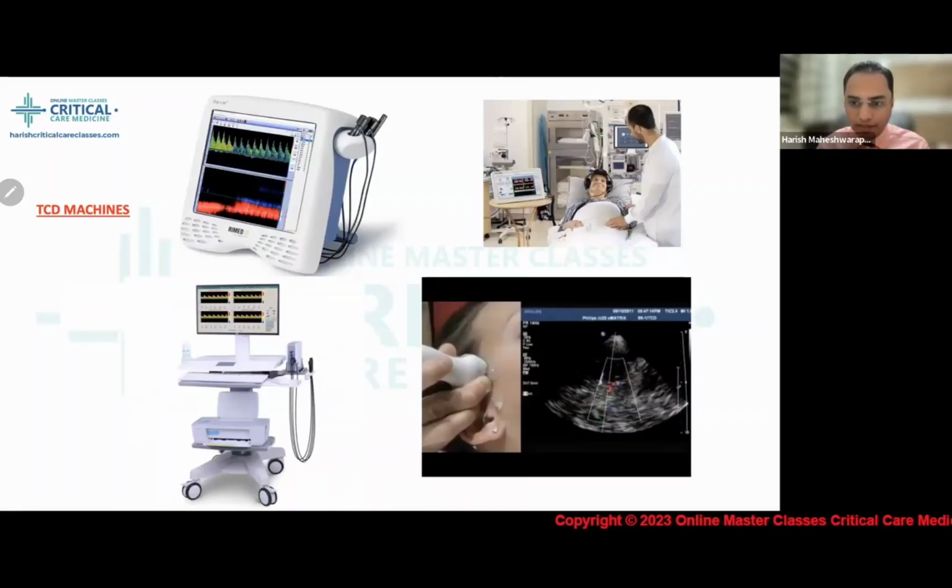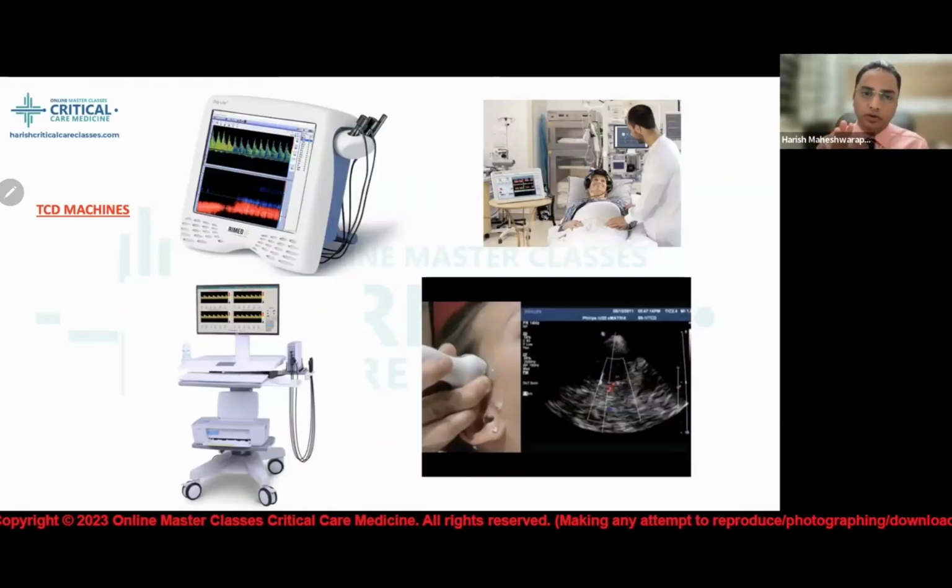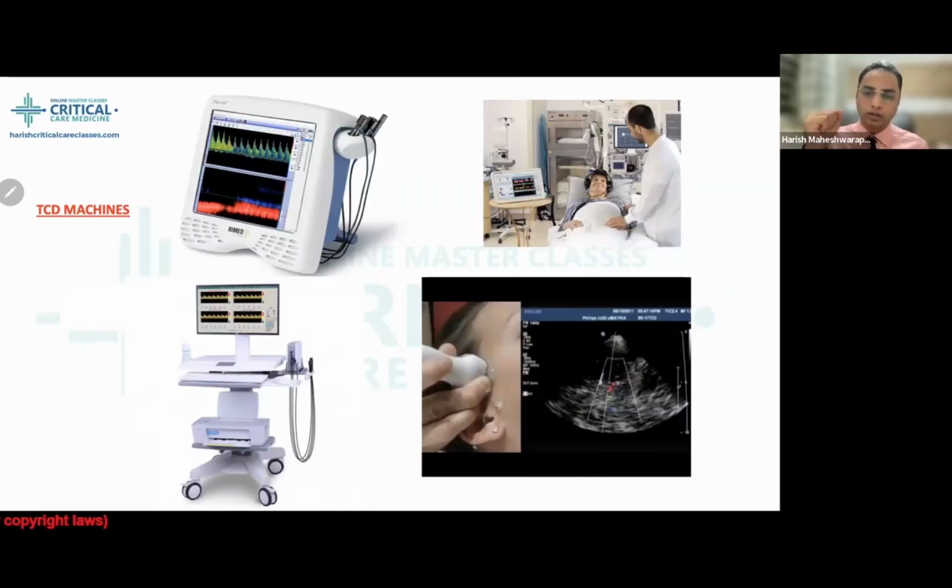That is exactly what we need at the bedside. When a patient has a subarachnoid bleed and has undergone coiling or clipping, we need to monitor him to detect vasospasm early. Suppose you do transcranial Doppler in the morning, and again in the afternoon or evening; you might miss the opportunity to identify this vasospasm. If you have continuous monitoring, we are able to get an idea about the vasospasm in a dynamic way. Otherwise, we have a regular ultrasound machine with a probe available.